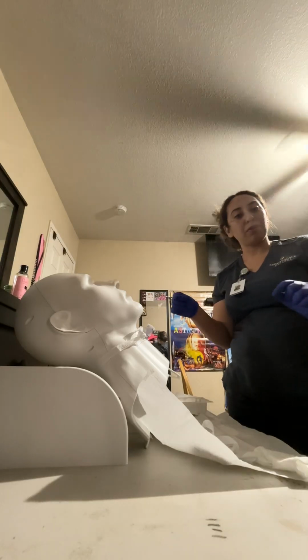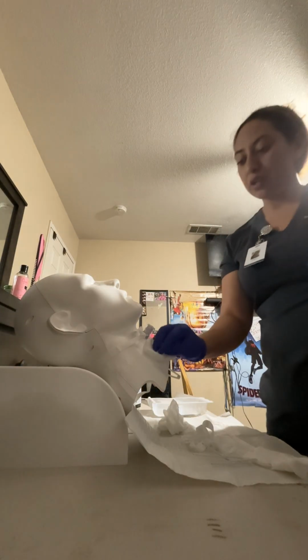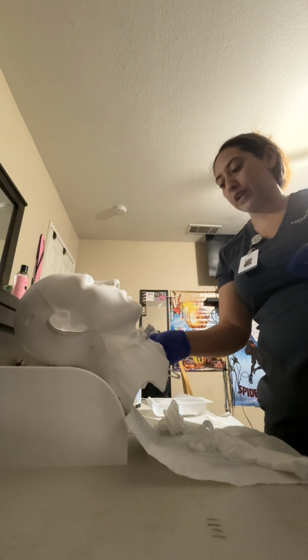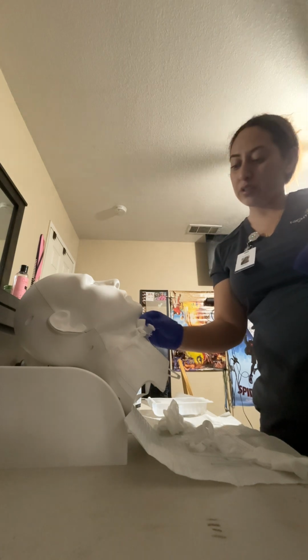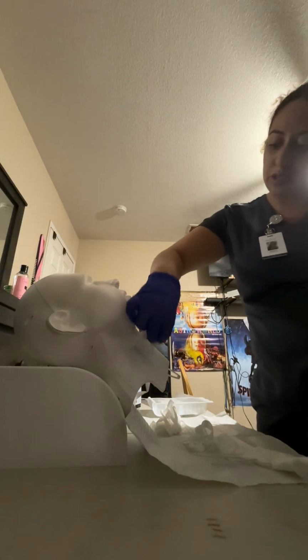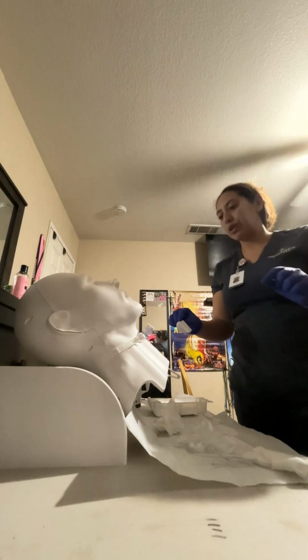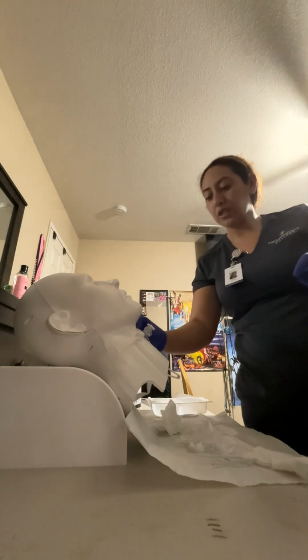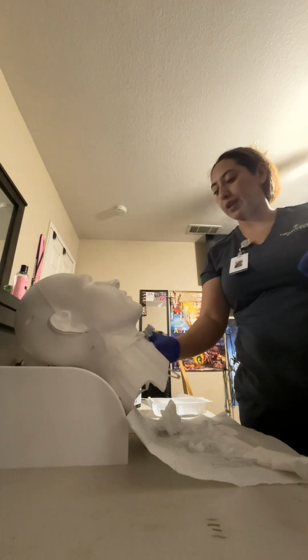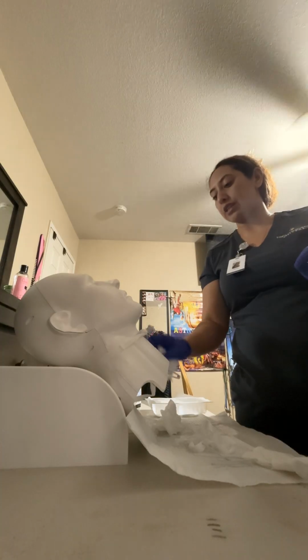Okay, I'm gonna grab a 4x4 dry gauze, and I am going to dry around his stoma site. We are clean now. I'm gonna ask my patient how he's doing. Hi Alfredo, you doing okay? Okay. Patient says he's okay. So I've cleaned around your stoma site. And now I've patted it dry. The next step is changing out your trach ties.